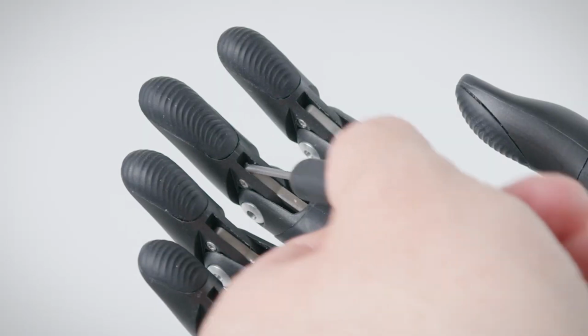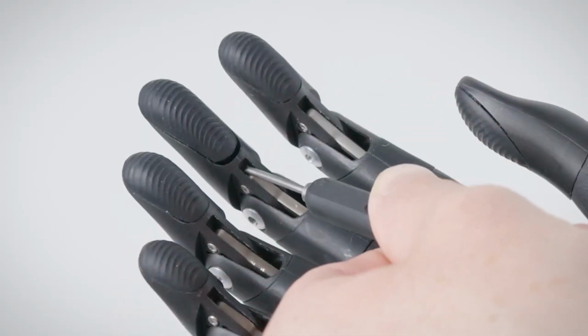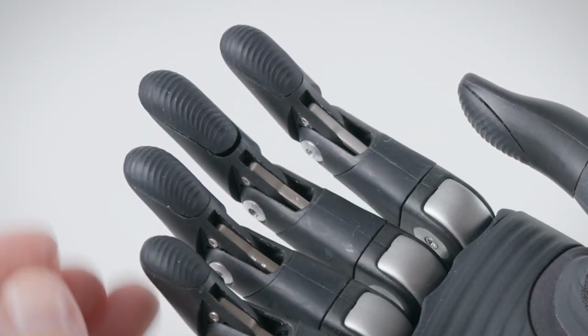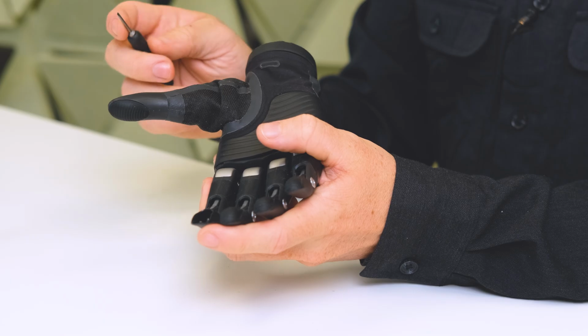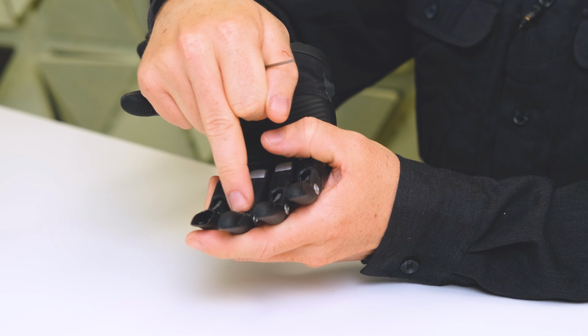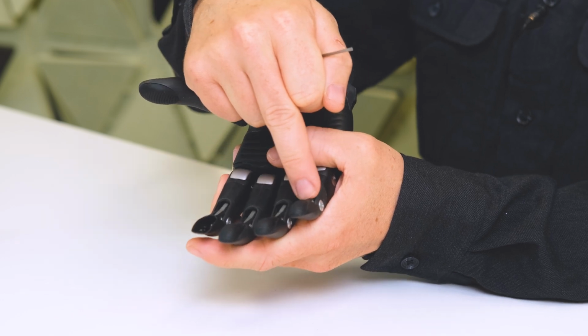To remove the grip tips, insert the screwdriver into the slot just above the metal bar, apply a small amount of pressure until it removes from the finger. You should be able to now remove the old grip tip completely. The same steps apply to the index as to the middle, the ring, and the little finger.